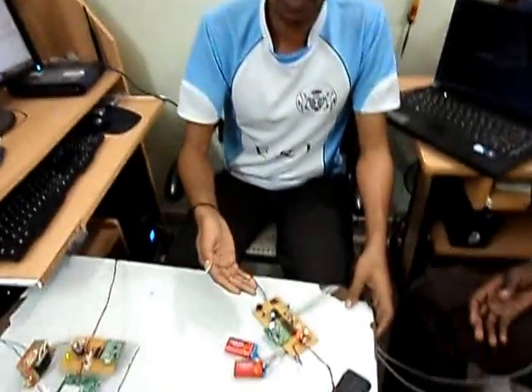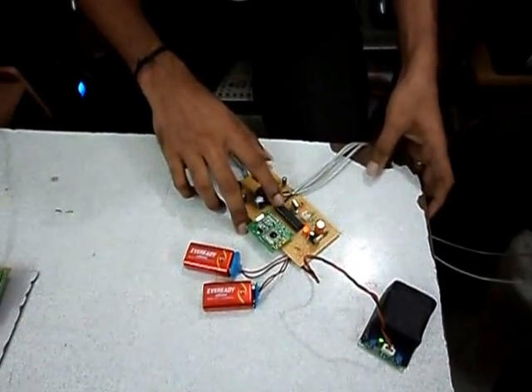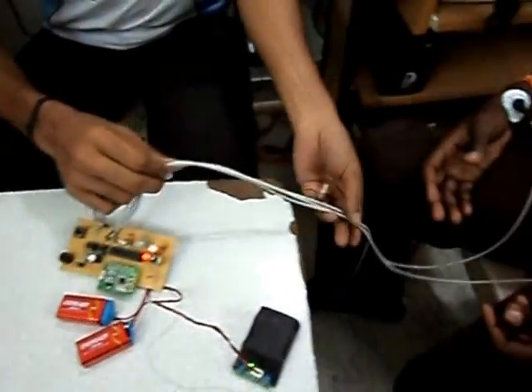Our project title is Remote Patient Monitoring System using LabVIEW. Here we have a remote module. It consists of a power supply and a PIC microcontroller where you burn our code. It uses 16F73 code. Here we have an ECG module connected to a patient.